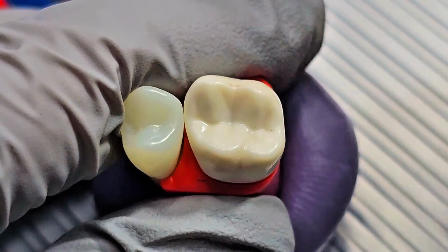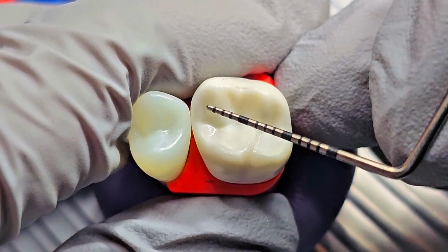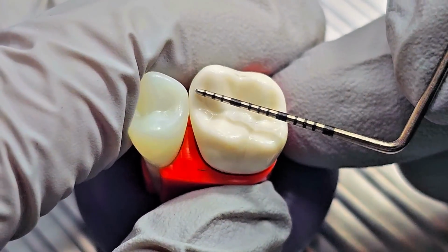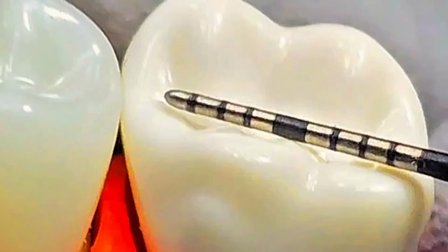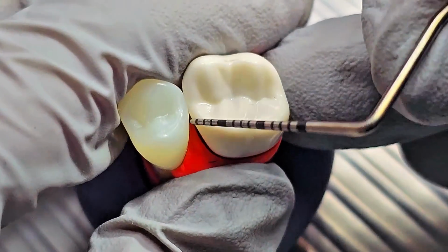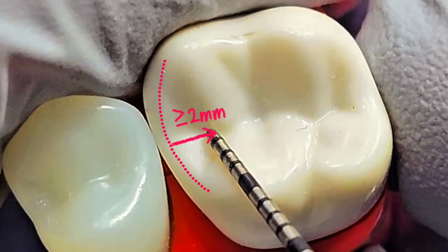Hello, in this video I'm going to help you master the access prep. According to the ADEX guideline, knowing the criteria is super important. For the mesial margin, the highest portion is the ridge. It is the ridge, not the outer surface. From the ridge, it should be 2 millimeters.